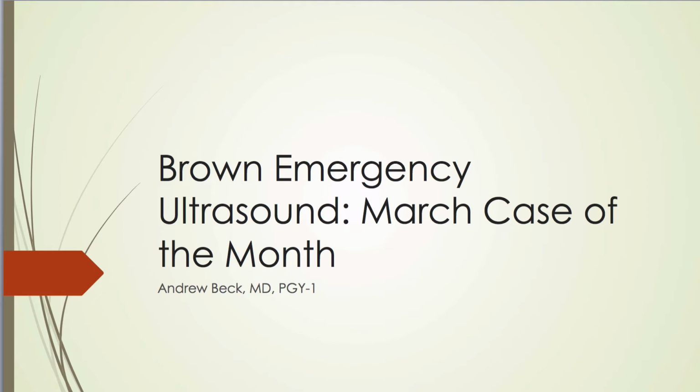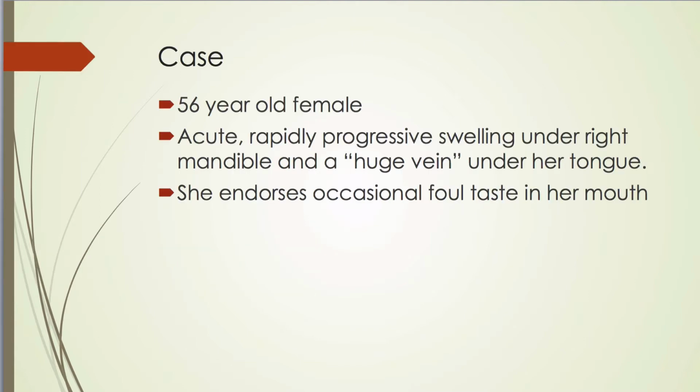This is the Brown Emergency Ultrasound Case of the Month for March. This is by Andrew Beck, one of our first-year residents. This is a case of a 56-year-old female.